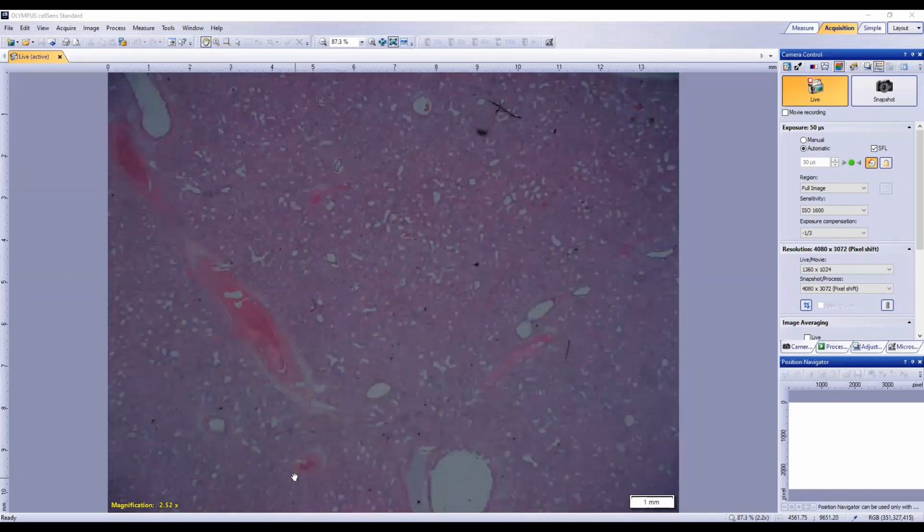Now, if this were a cow with an acute lung, what's one of our major differentials? Pasteurella could be one, multocida. Yes, because that's got similar toxins. Mannheimia, but that's not the morphology that Mannheimia normally follows. Exactly. If this was Mannheimia or Pasteurella, we'd be expecting multifocal lytic necrosis and those great big expanded alveolar septa with lots of edema and things like that.